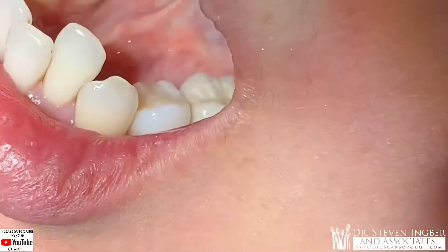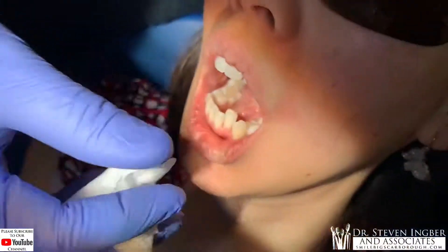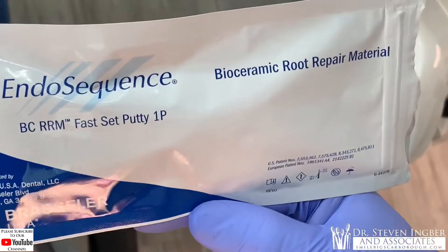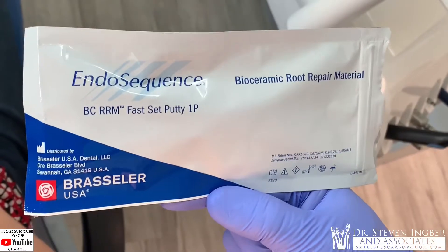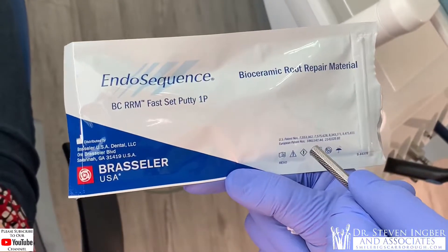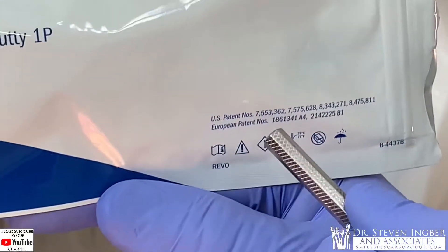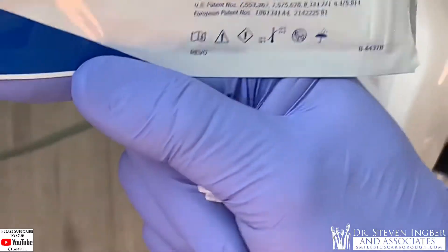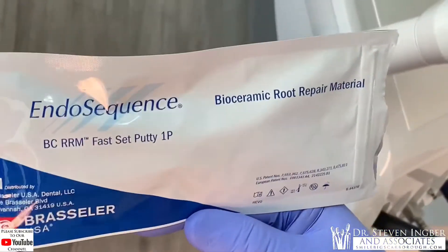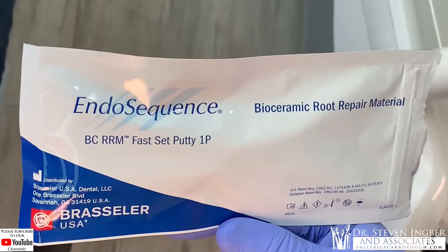I used a high-tech material that we've shown in my other YouTube videos — the Endo Sequence bioceramic root repair material from Brasseler, a US product. Look at all the patents here: four US patents and European patents as well. For all you lawyer types out there, getting a patent is probably a few million dollars worth of lawyer's fees, never mind the millions invested in designing and inventing the material. So it's like a little putty and we use it where the defect is in the root.